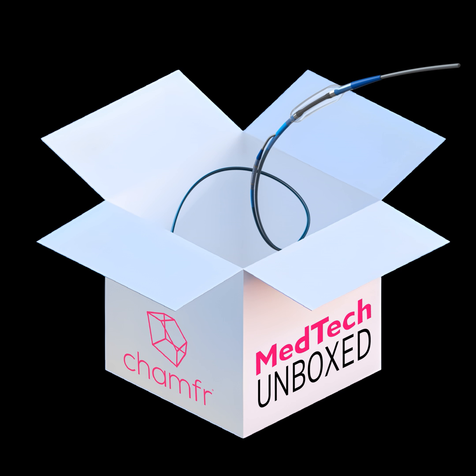I guess it would be pretty complicated, but maybe there are plans to add laser cut hypotube reinforcements in there at some point, right? I looked into that, and there's no good way to calculate it analytically without using FEA, unfortunately, that I could find. But that would be ideal. Yeah. Thanks for sharing that. I think that's really slick.